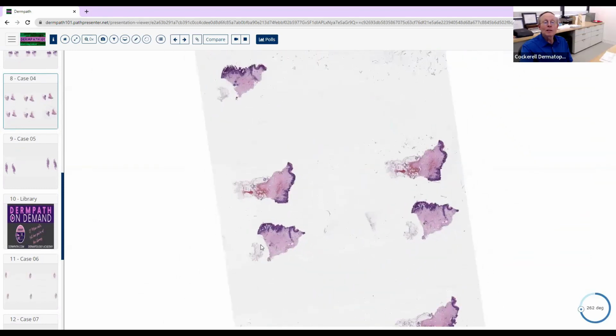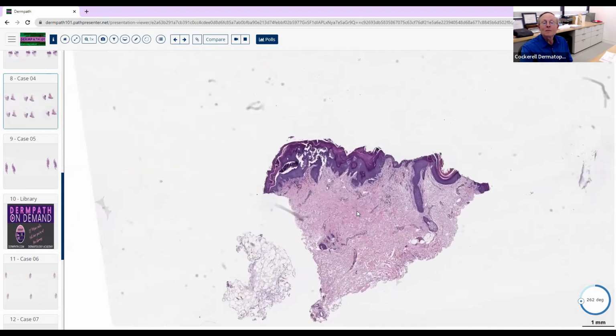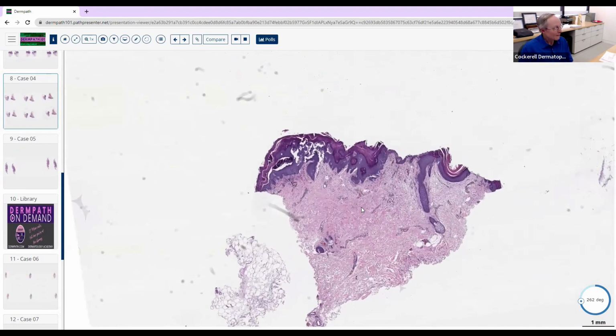Okay, now we'll move to something a little less nefarious, but important nonetheless. Yeah, I can take this one. So this was a punch.